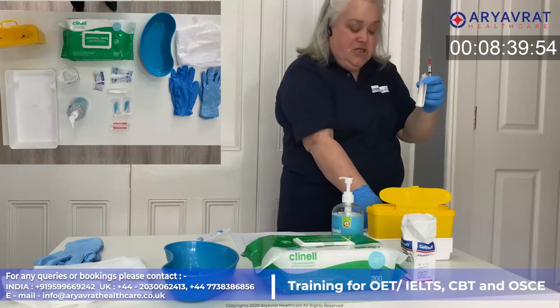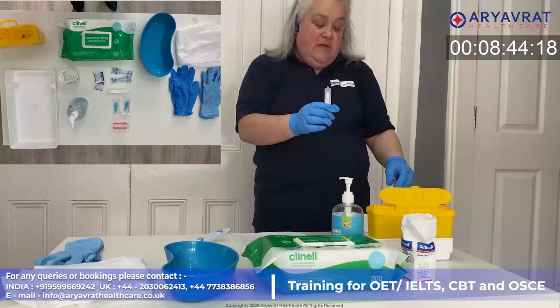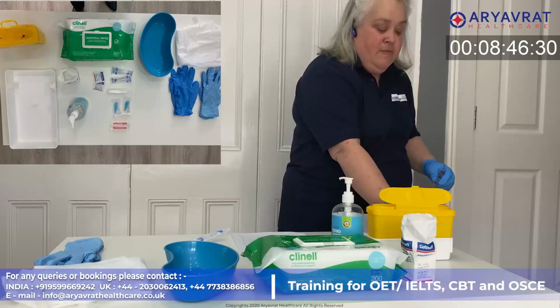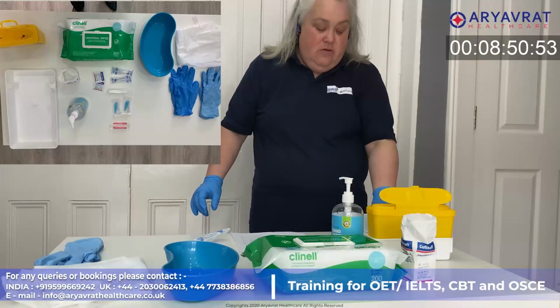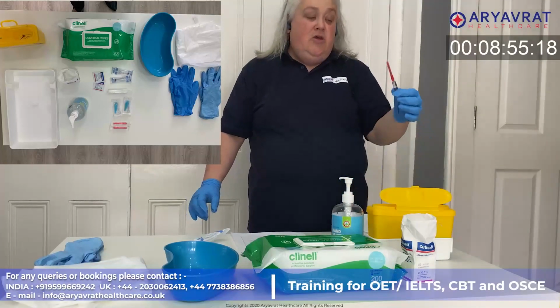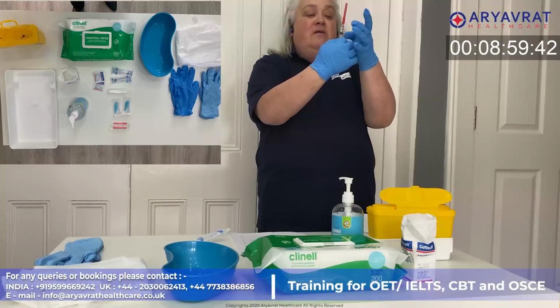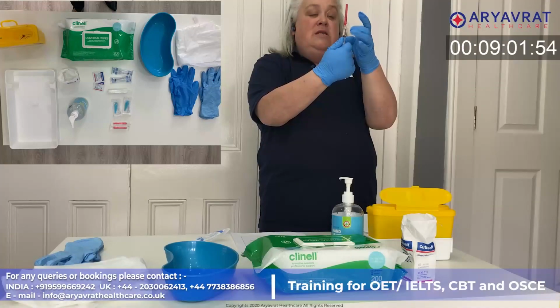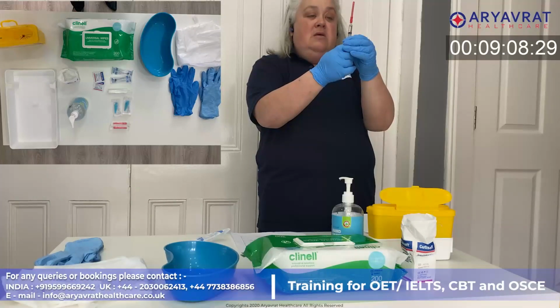of the medication. Now I'm going to put my vial back into my tray because I'm going to need to make a note of the batch number, and I am going to sheath my needle using the single scoop mechanism so that I can make sure that I have got enough and that there's no air bubbles or anything in my syringe. Okay, I am happy with that.